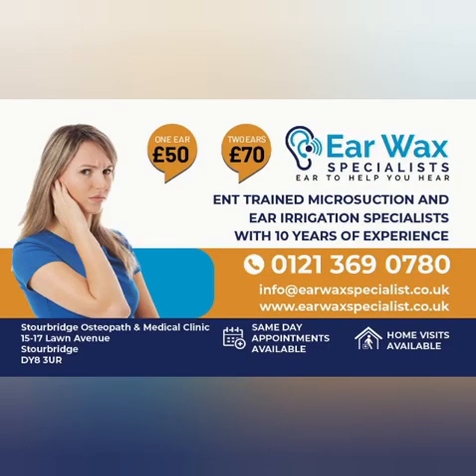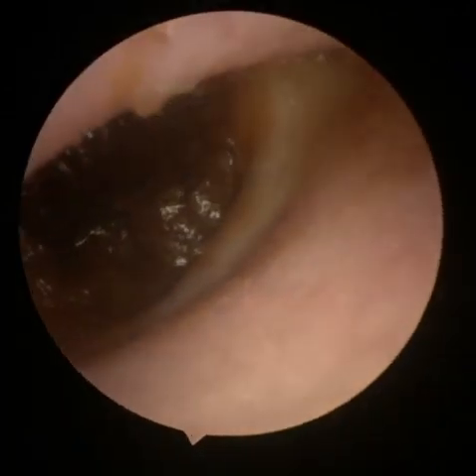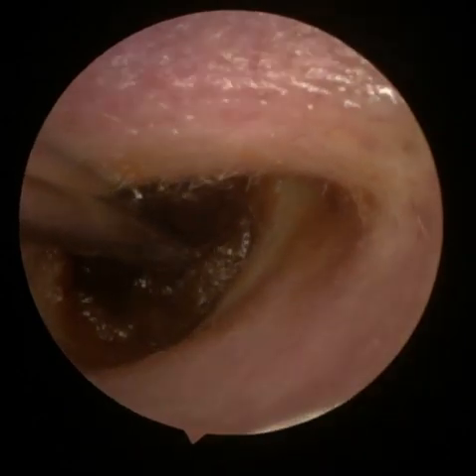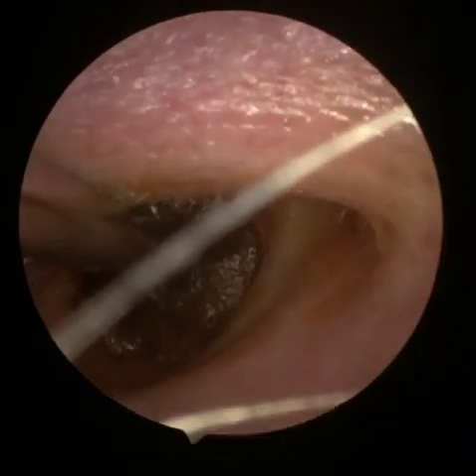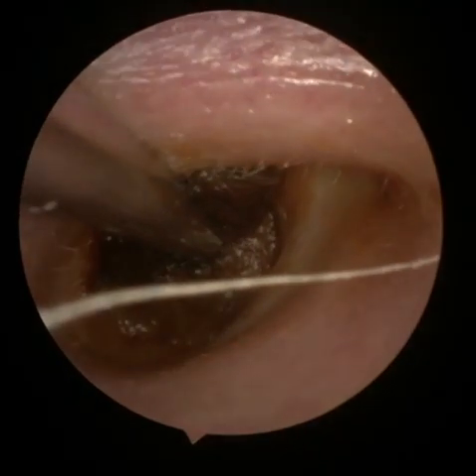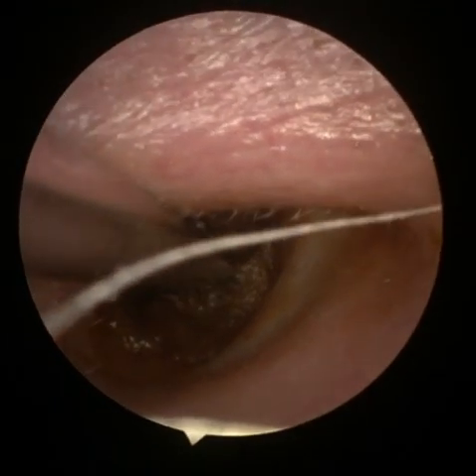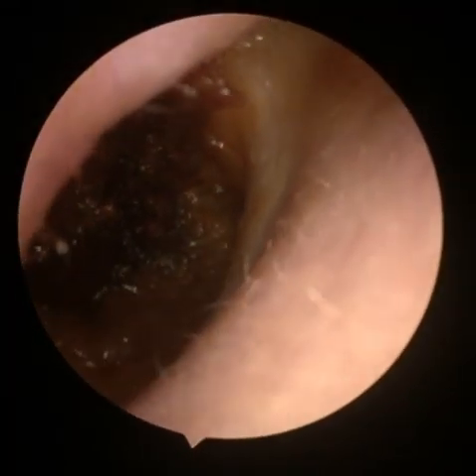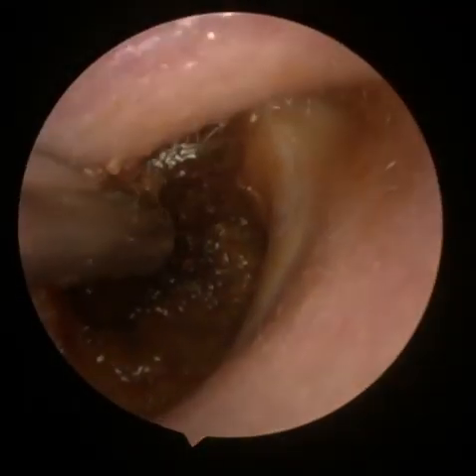Hi, good afternoon all, this is Adam from the Earwax Specialist. This is one of our patients who's come in with deeply impacted wax. This is always the more tricky type of wax to remove — incredibly sticky. One of the biggest problems you usually find with this type of wax is that it keeps blocking the cannula, and we're using a standard two-millimeter cannula. This is impacted wax just behind that second bend — the patient used a cotton bud which pushed it that little bit further back.